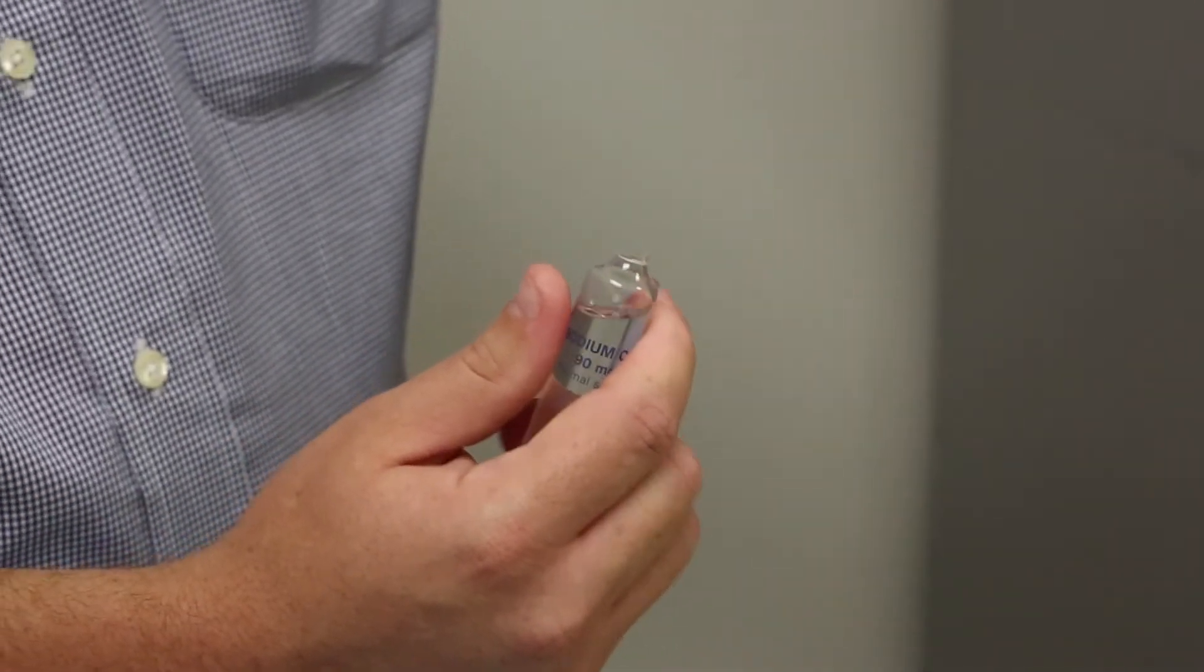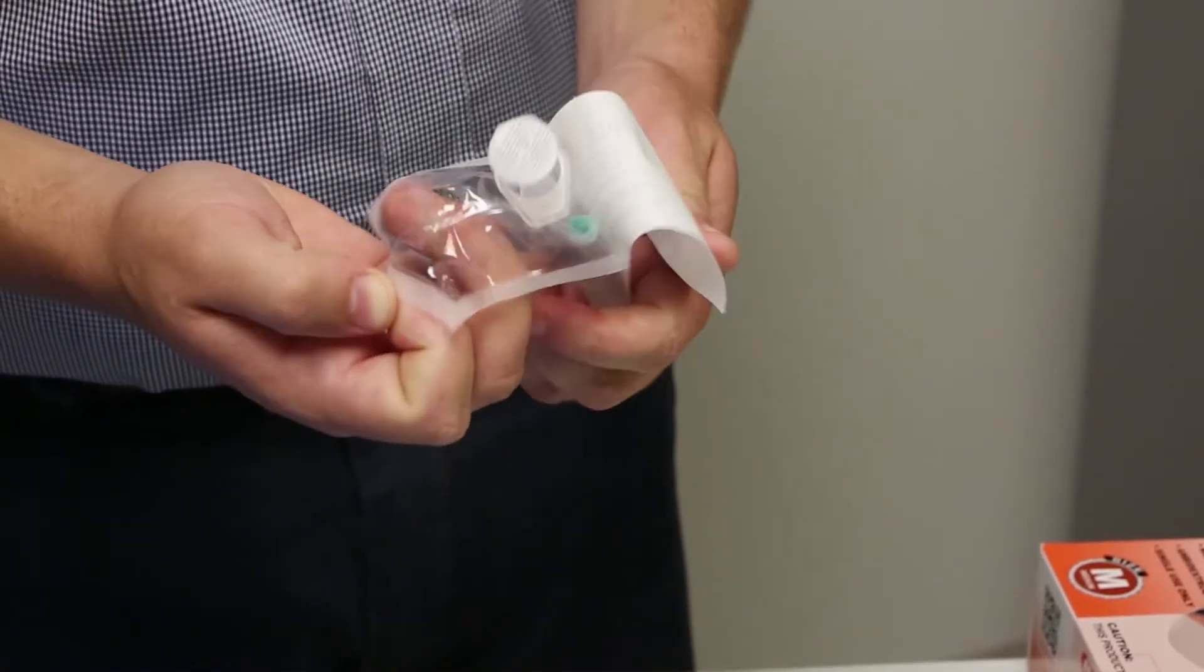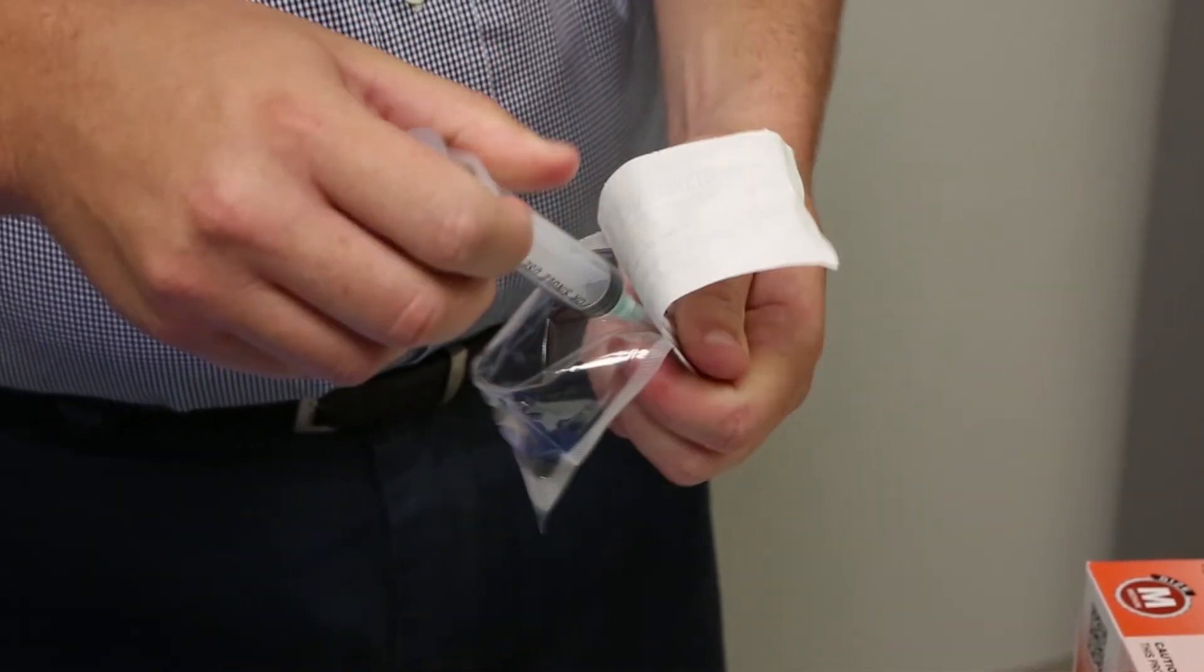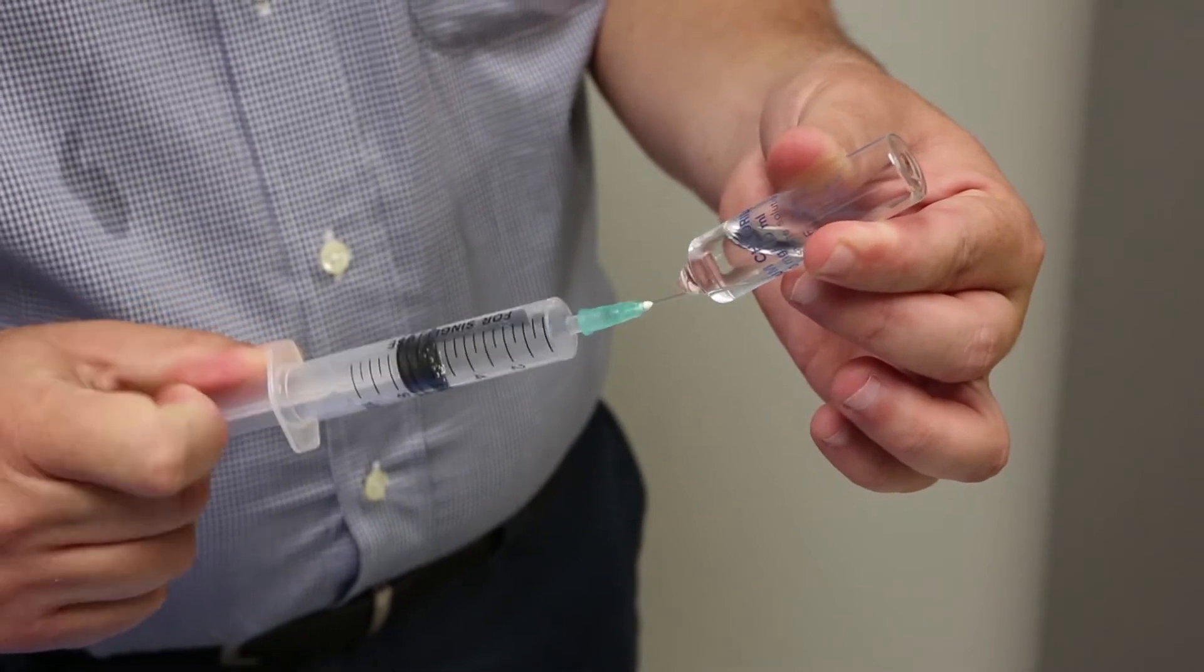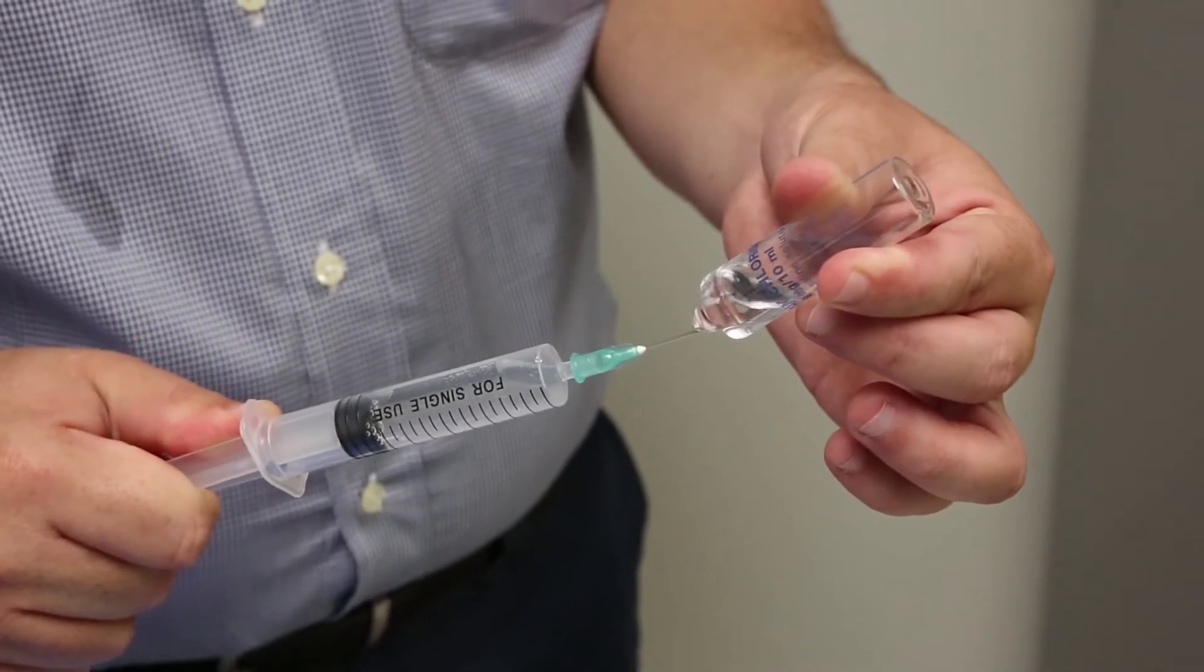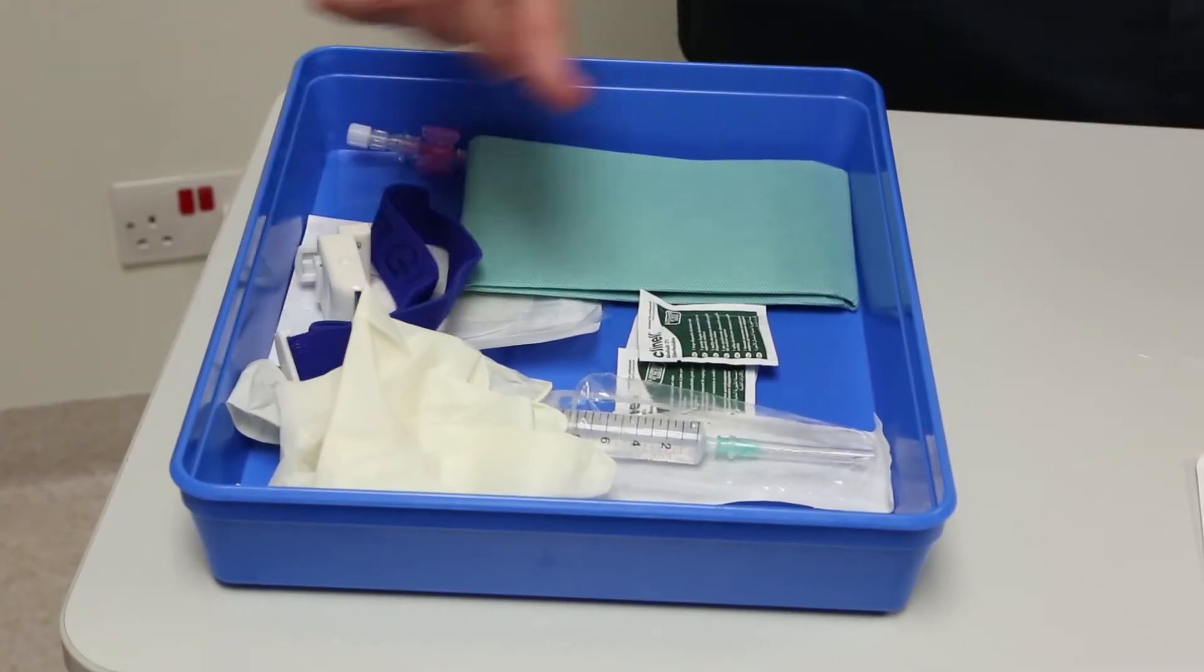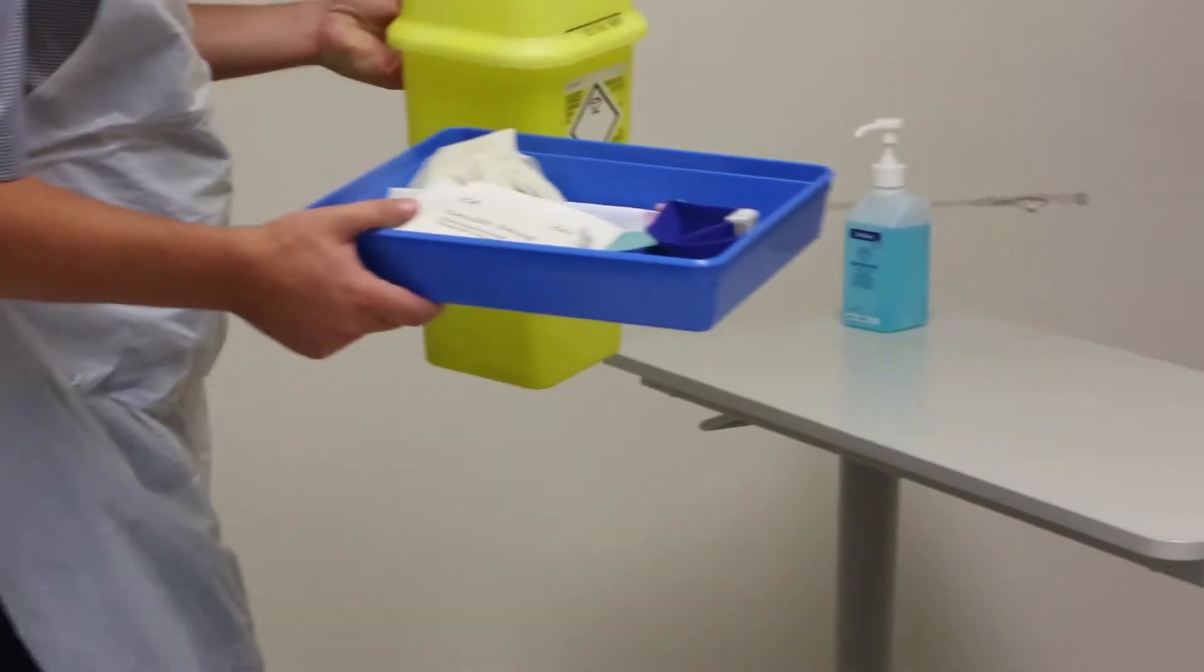Step 6. Draw up the cannula flush using sterile 0.9% saline for intravenous use. If an extension set is to be used, prime with sterile 0.9% saline for intravenous use. Protect the key parts that are not in use by using sterile caps or stoppers. Proceed to the patient.